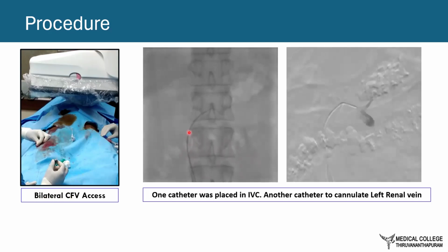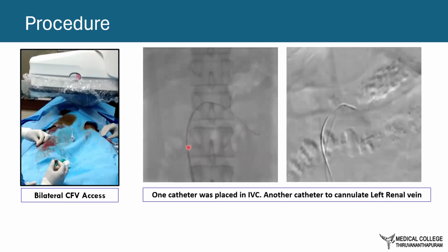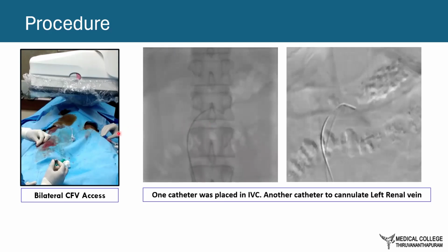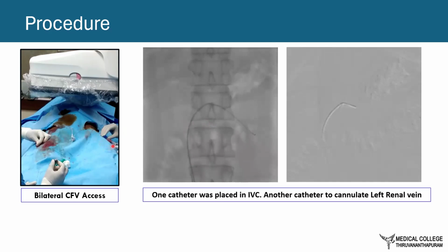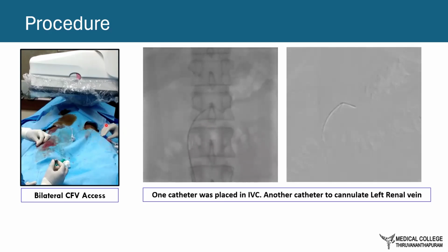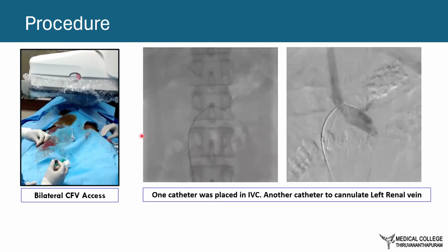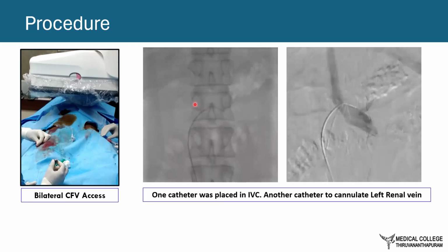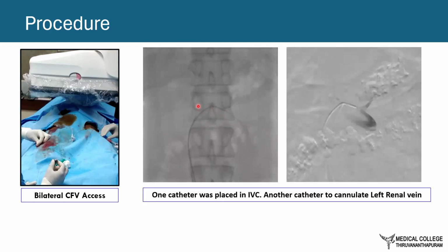This is to take the peripheral sample from the IVC at the infrarenal level. Many institutes take the sample directly from the sheath access itself, which is also enough as per literature. But in our institute, we follow the protocol wherein we take a sample right from the IVC below its junction with the renal vein.